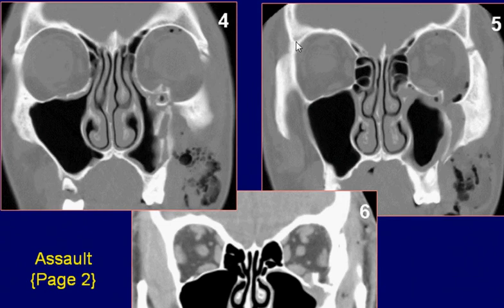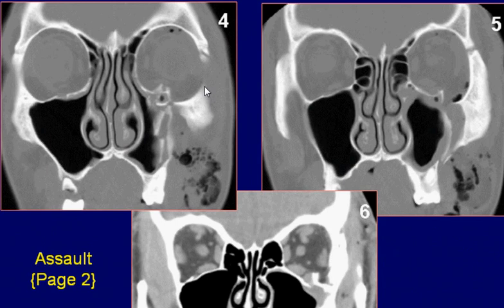Coronal CT images of the face in bone window settings reveal depression of the left orbital floor and lateral wall of the maxillary antrum with bony discontinuity.